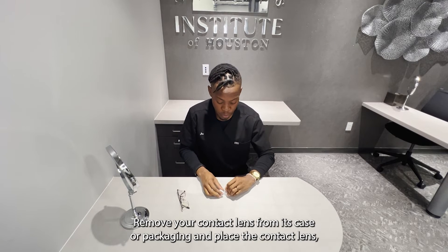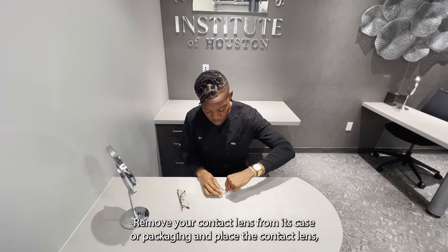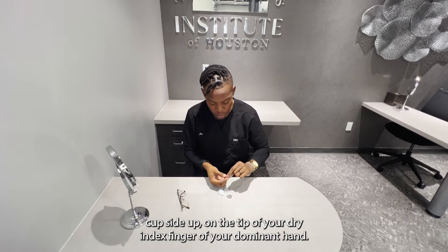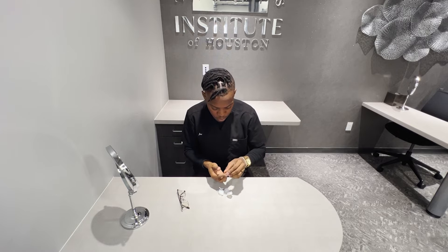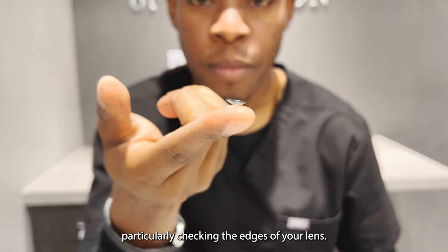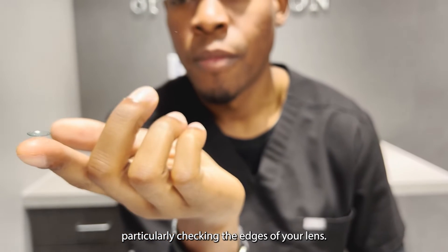Remove your contact lens from its case or packaging and place the contact lens cup-side up on the tip of your dry index finger of your dominant hand. Inspect the contact lens for any particles, debris, or cracks, particularly checking the edges of your lens.